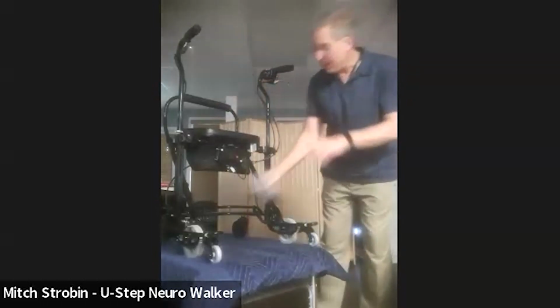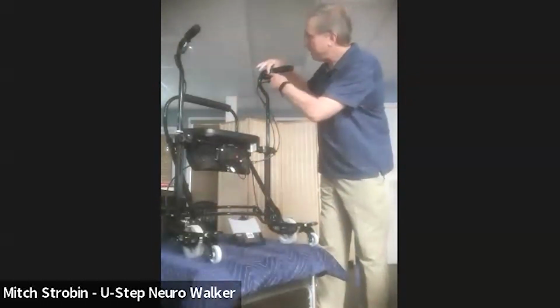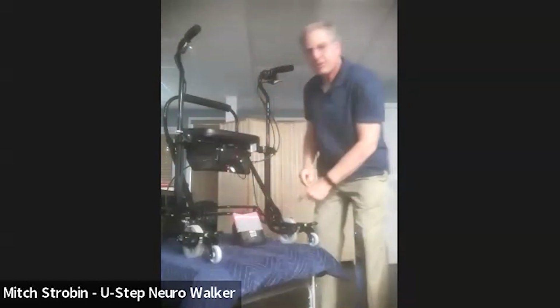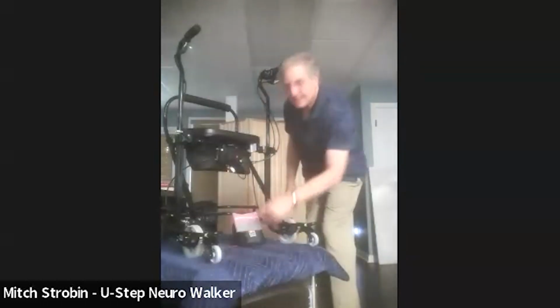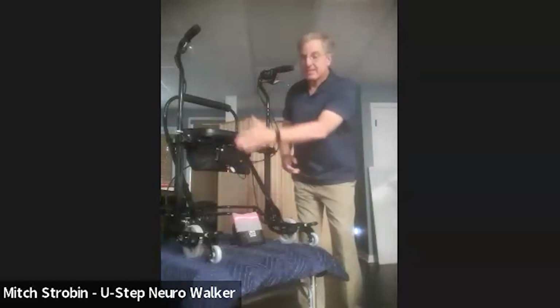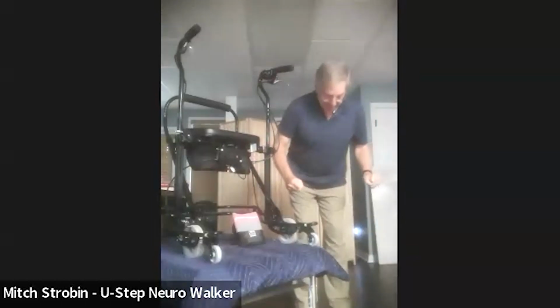It's on the right handlebar. And what it does is, there's a red button and 2 black buttons. If I push the red button in, and hopefully you can see that, there's a red laser light that spans the width of the U-step. Studies have shown that that red laser helps unfreeze someone with Parkinson's. It also serves as kind of a step guide to aim for the line, aim for the line, aim for the line. Now, we're not saying stare at the ground. It's more just seeing that red laser does work to help unfreeze someone.